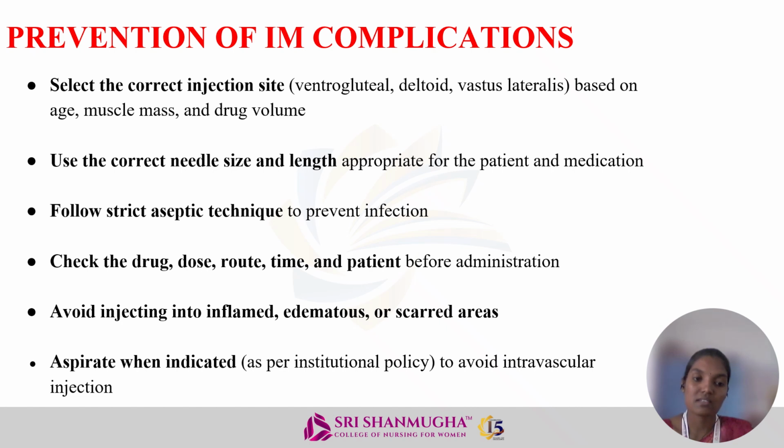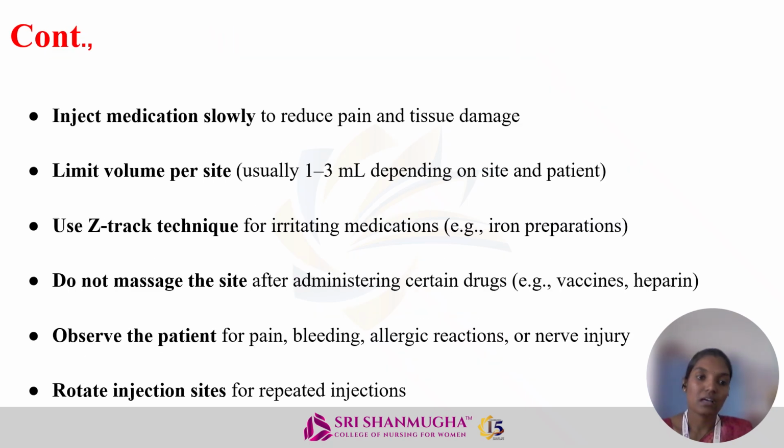Next one, avoid injecting into inflamed, edematous or scarred areas. Next one, aspirate when indicated to avoid intravascular injection. Next one, inject medication slowly to reduce pain and tissue damage. Next, limit volume per site, usually 1 to 3 ml depending on site and patient.